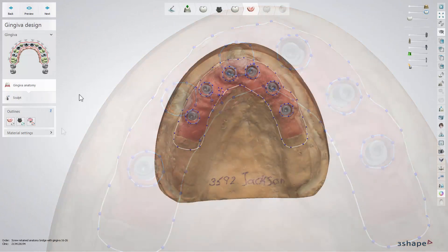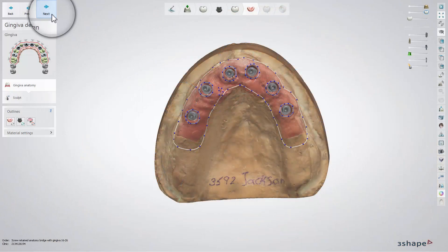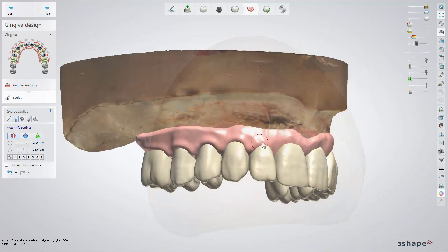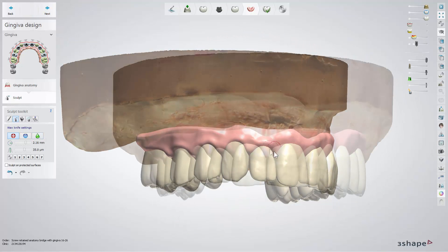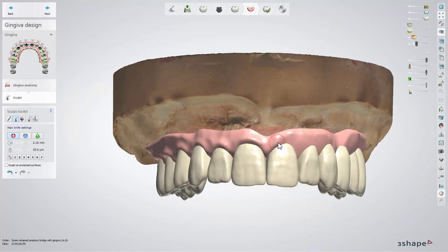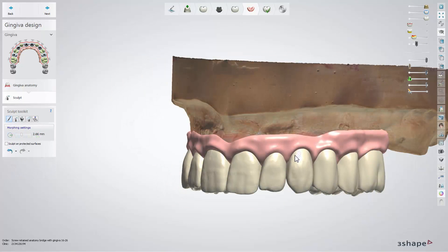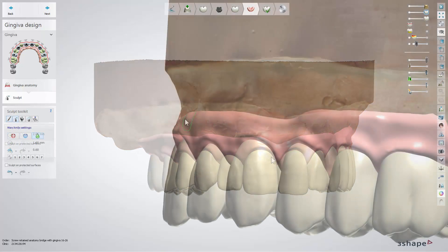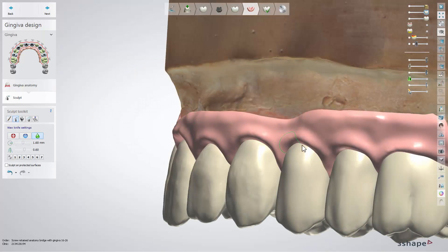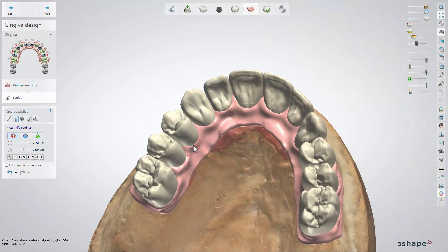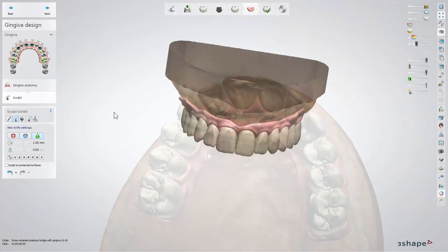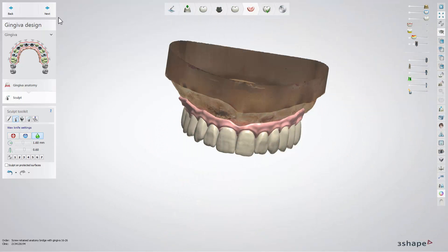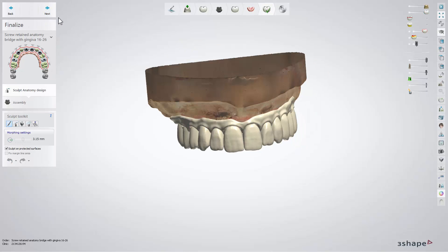Once all outlines are created, click next to move to the Sculpt step, where you can use the Sculpt tools to shape the Gingiva. When ready, go to the next step, which is Finalize.